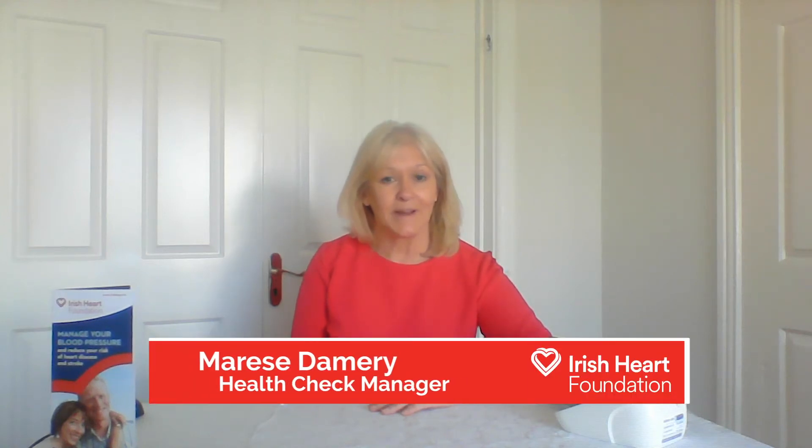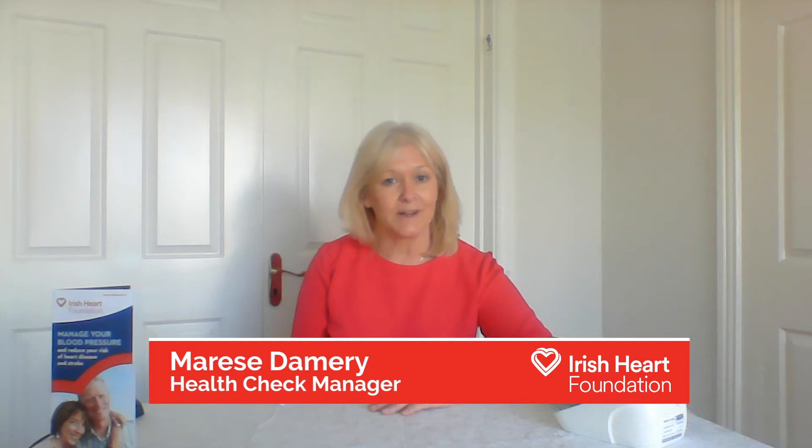Hello, my name is Maurice and I'm going to talk to you today about how you can check and monitor your blood pressure accurately at home using a home monitor device.